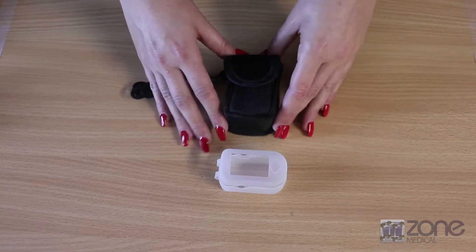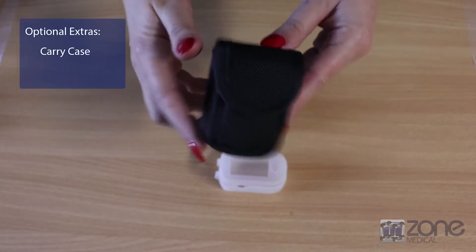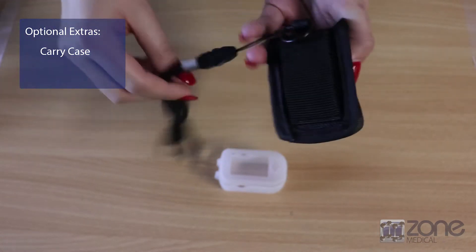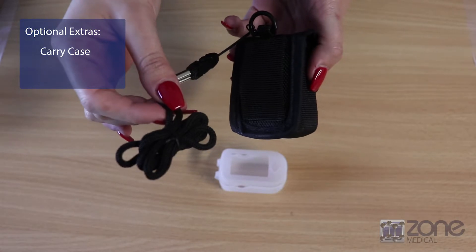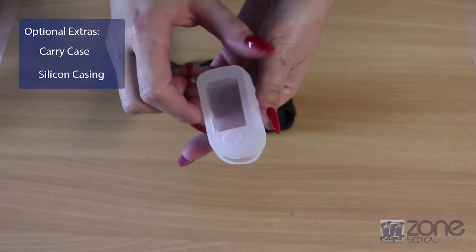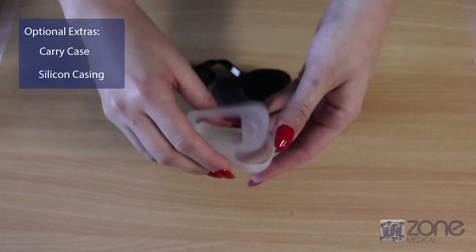The optional extras that come with this pulse oximeter are the carry case. You can attach it to your belt or around your neck with the lanyard, and you've also got a silicone casing to protect the ChoiceMed pulse oximeter.